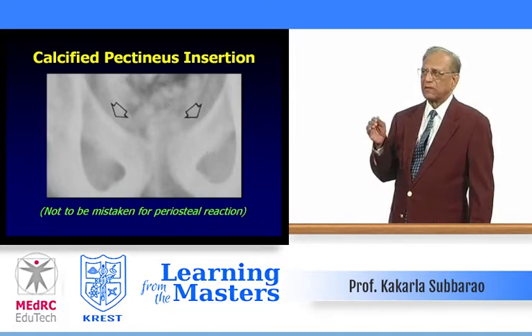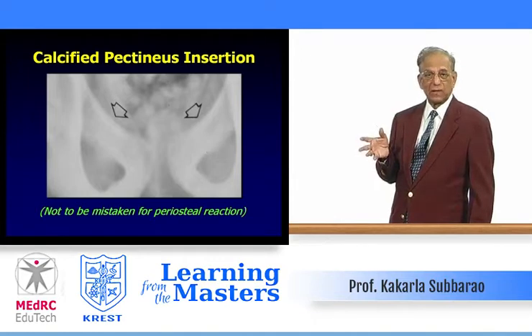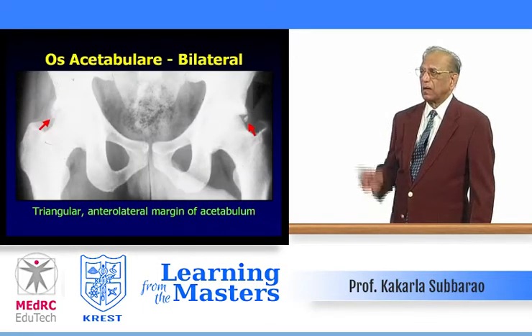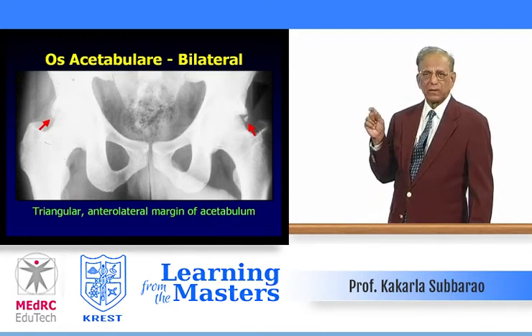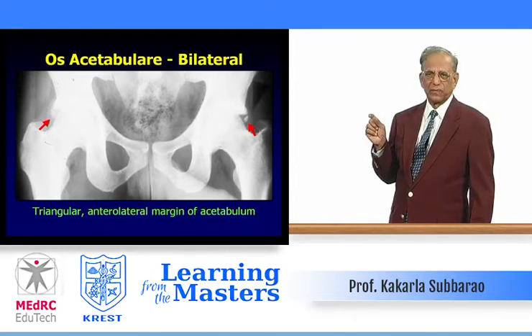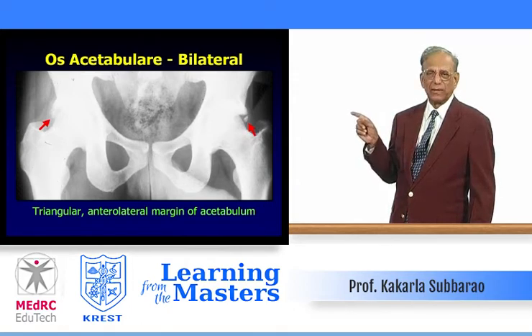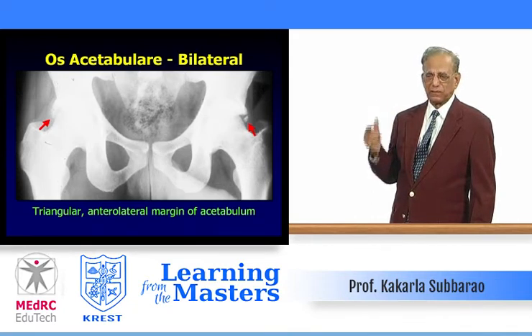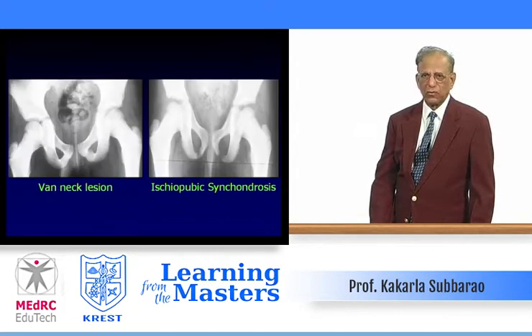A calcified pectineus insertion on the iliopectineal line is often mistaken for a periosteal reaction or even Paget's disease, but this is a normal variation in elderly people. On either side of the hip in the acetabular area, there are small triangular ossicles — these are not detached osteophytes but are called os acetabuli, accessory ossicles, usually triangular, located at the anterolateral margin of the acetabulum.